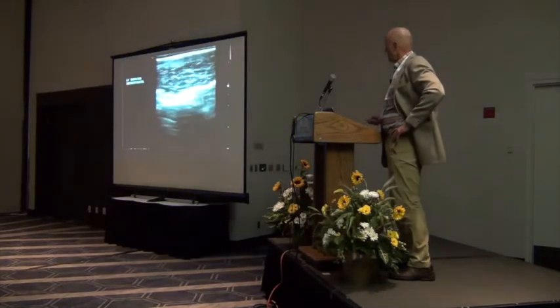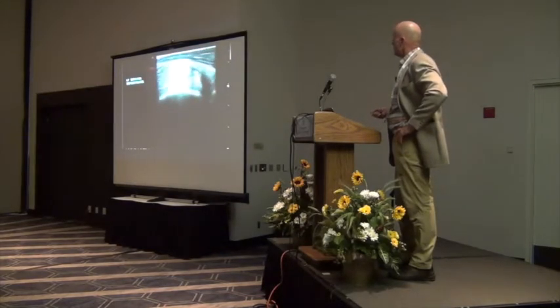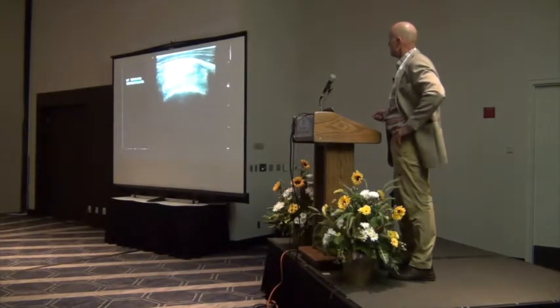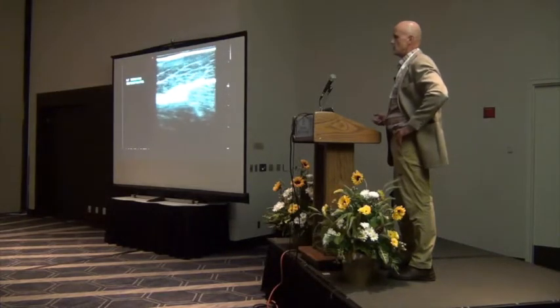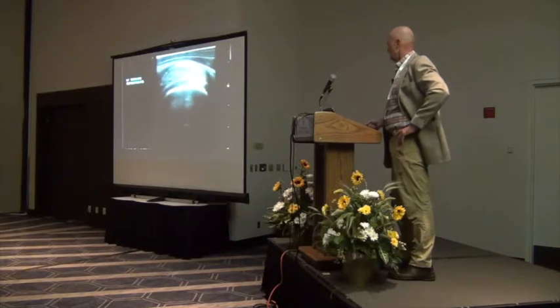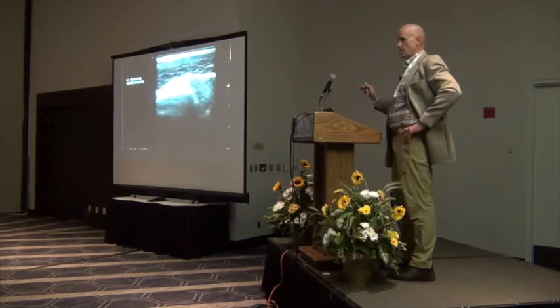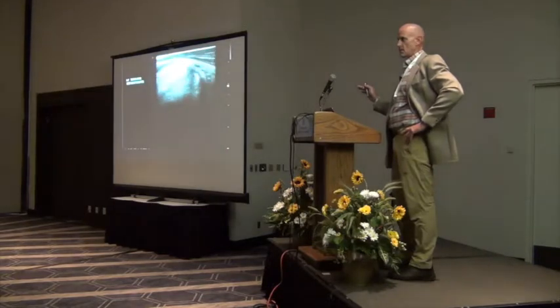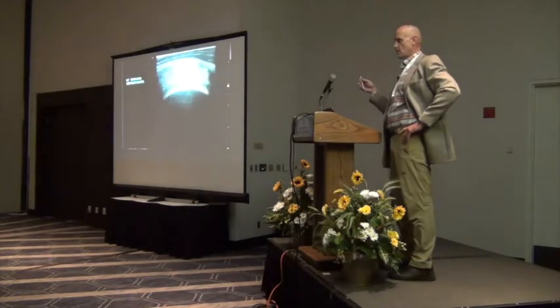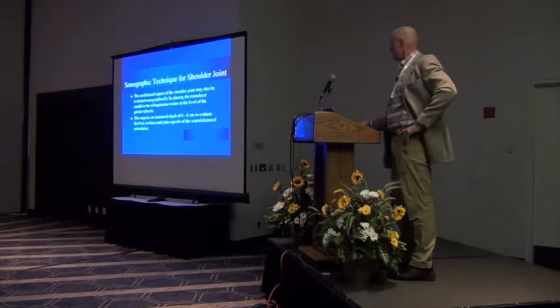Here we are up in the muscle, and it's kind of rectangular. Now it's coming down and forming a trilobed bundle as it crosses the humerus. And that's right where your bursa is, sitting underneath there. All right? So bone contour is very important, particularly here. That's the most lateral structure we have. And if you've got damage or trauma, you'll see irregularity under there and fluid accumulation.